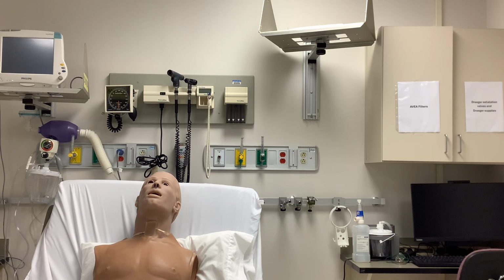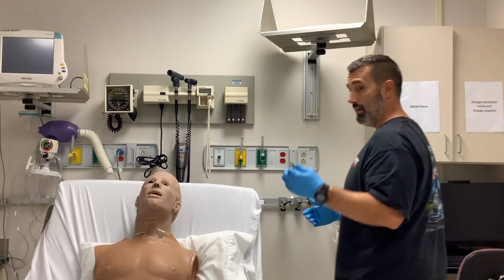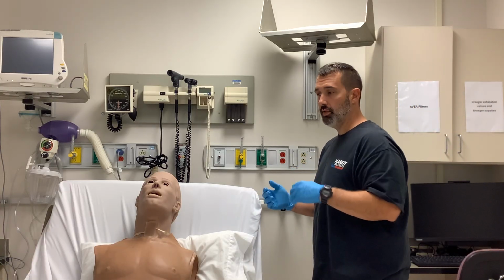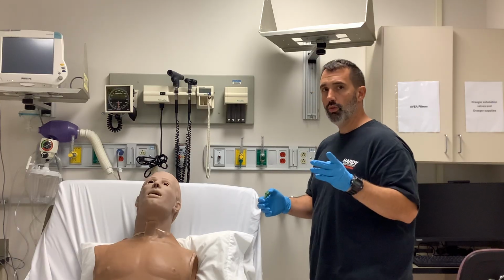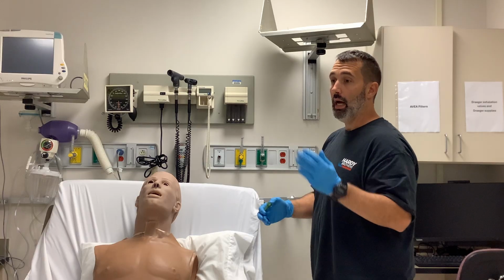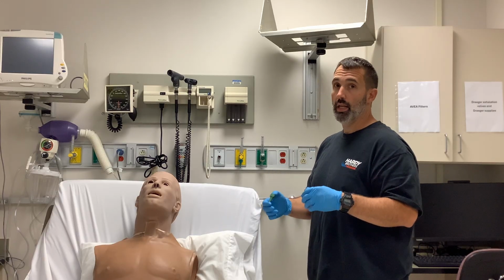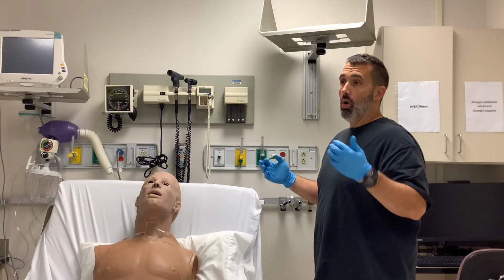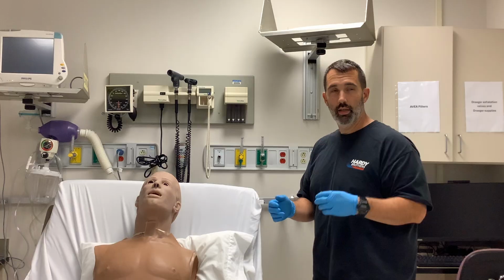Let's talk about air entrainment devices today. So we'll also talk a little bit about our high flow devices and our low flow devices. Remember, pretty much the distinct difference between the two of those is a low flow device cannot meet or exceed the patient's peak inspiratory flow demand, as opposed to our high flow device, which can meet or exceed the patient's peak inspiratory flow demand.